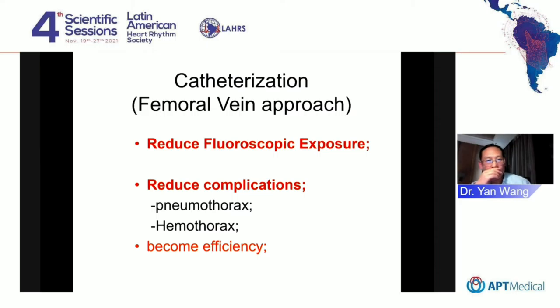Then the time, I think, is needed. I just want to talk about the catheterization, mainly the femoral vein approach. Why we do the femoral vein approach: in recent almost 8 years, almost 100% of all procedures, we just perform catheterization into the coronary sinus via the femoral vein.